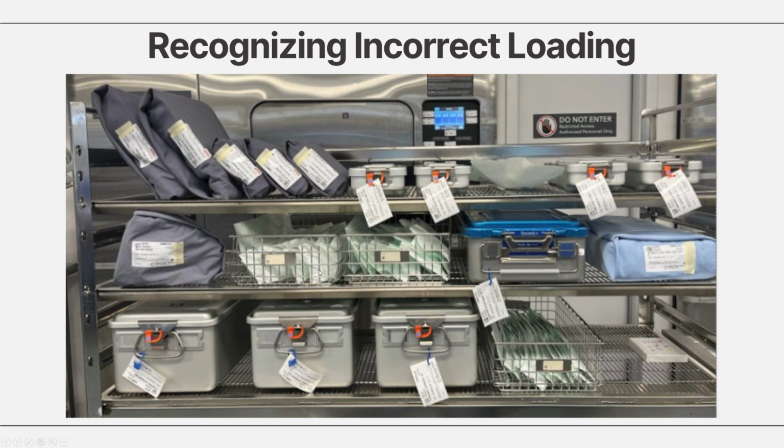So like I said, rigid containers, not just because they're heavy, should be placed on the bottom if you can help it, right? So this one would be best placed here where the basket of peel pouches is. And then the peel pouch baskets should not be placed below anything heavier than it or anything metallic, and even bundles like this, linen bundles. So it would be best to move all of these on top of here, all right?